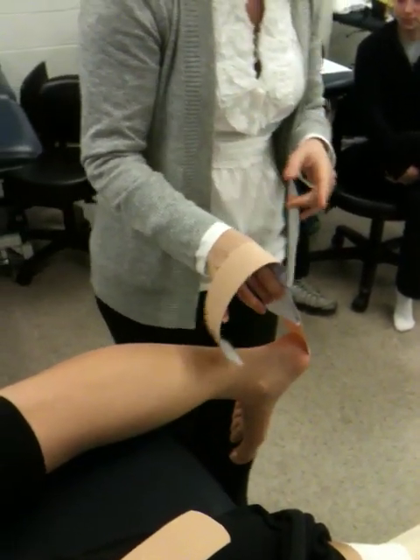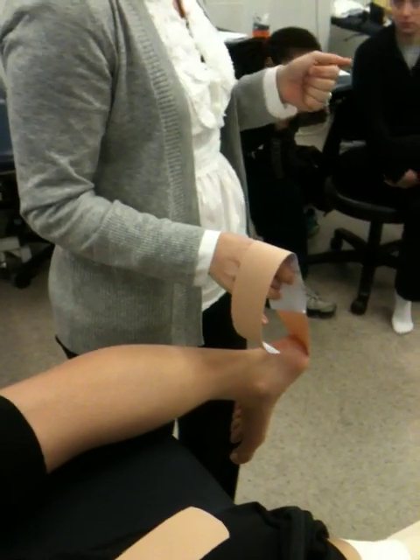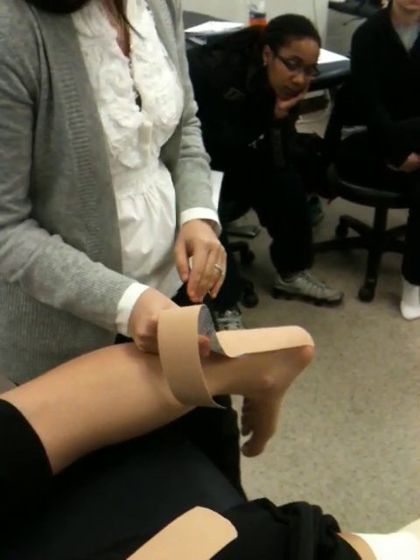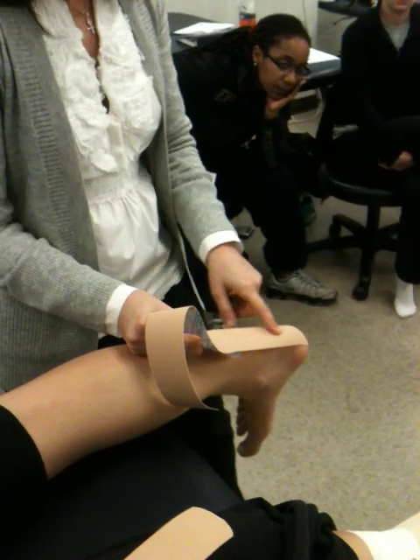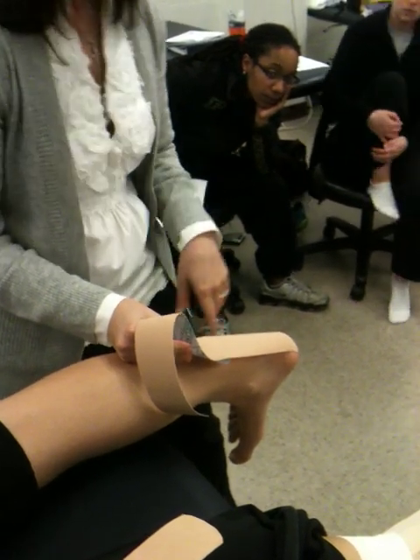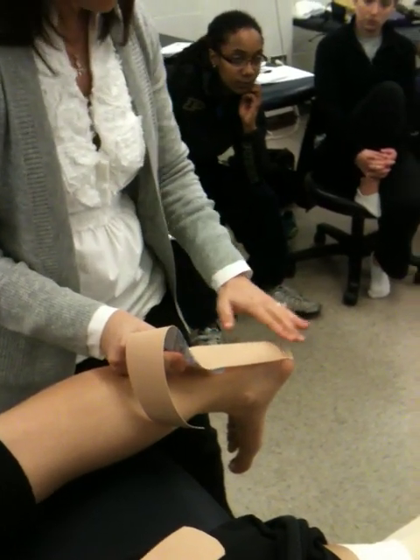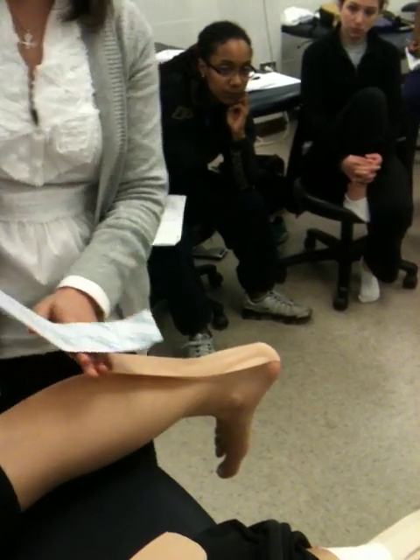If I know I've got any form of tendon injury, I can do a tendon correction on the kinesio. I'm going to pull out about 50 to 75 percent of my stretch to put onto my tendon. That's where we're really seeing a lot of the fibers and the patterning, and I'm going to make sure I lay that piece down.